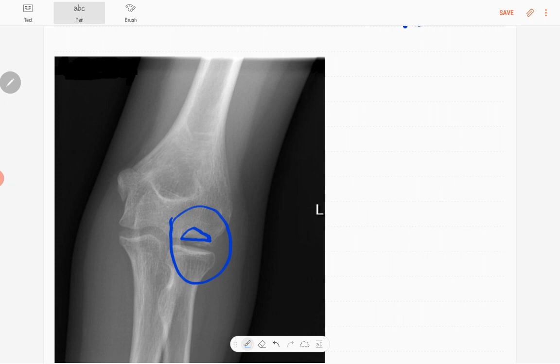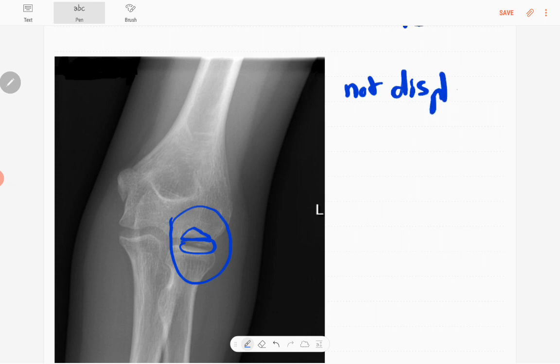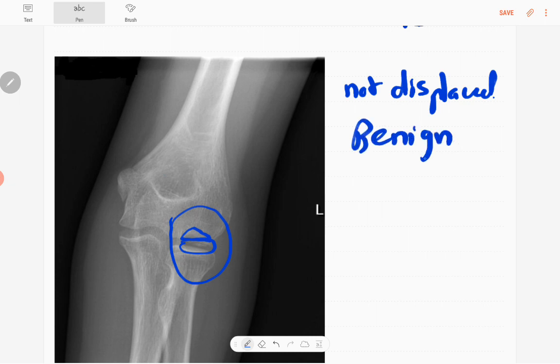You can see a loose body adjacent to that lucency — so it is detached but not displaced. There are no associated soft tissue components and no periosteal reactions, so it is a benign lesion.